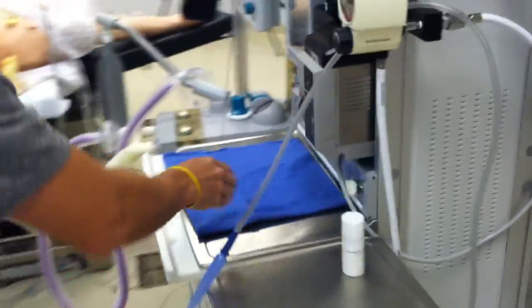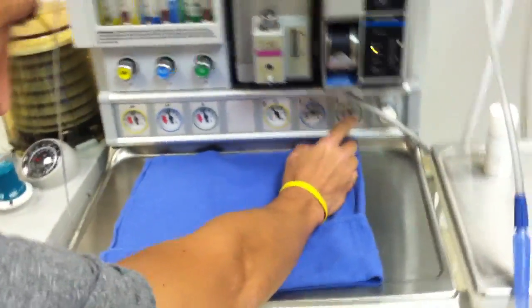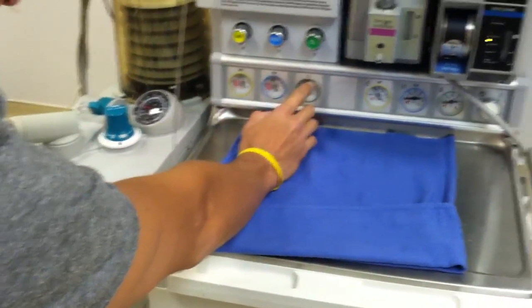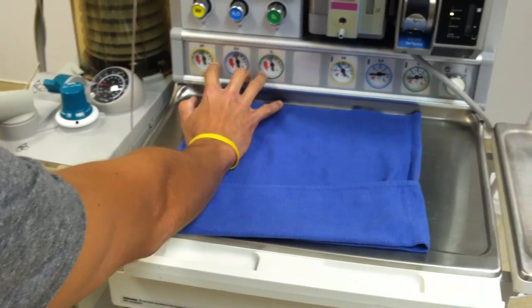Now I'm going to come around here and check my cylinder pressures. Make sure that I have, for oxygen, a minimum of 1000 PSI — we're of course empty here. While I'm here, I'm also going to check my pipeline pressures and make sure that those are all at 50 PSI.